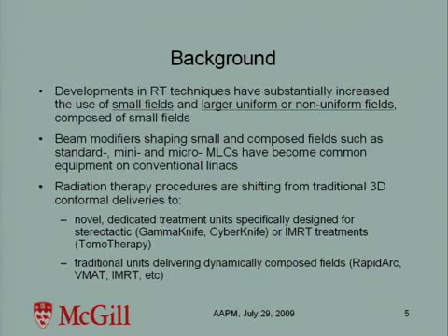So, you know that developments in radiotherapy technique have moved towards the use of small fields or large uniform fields consisting of a multitude of small fields. And this has been accomplished by using beam modifiers such as MLCs, micro MLCs, and this has become common equipment on accelerators.